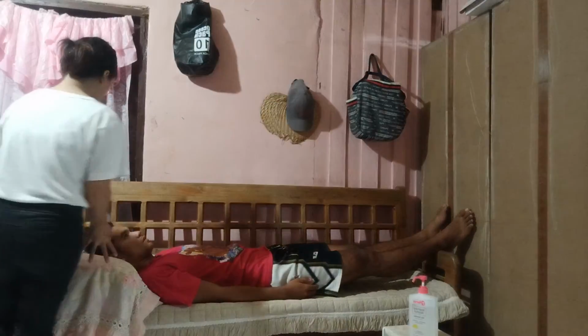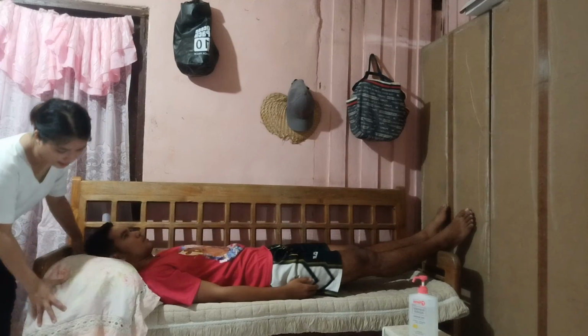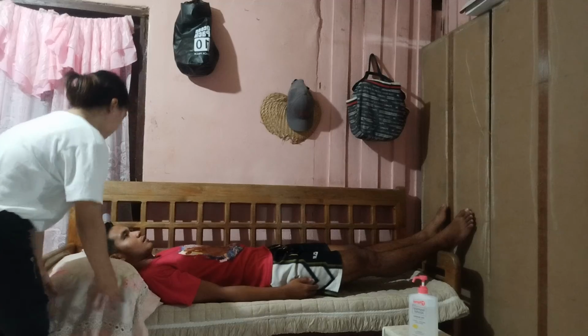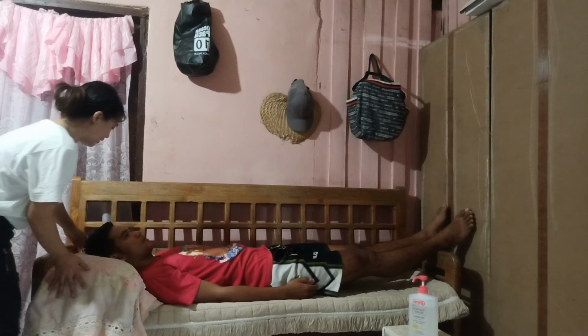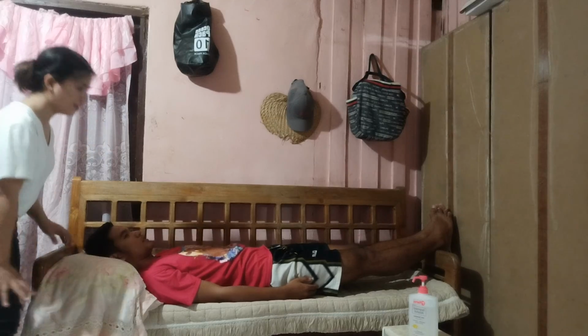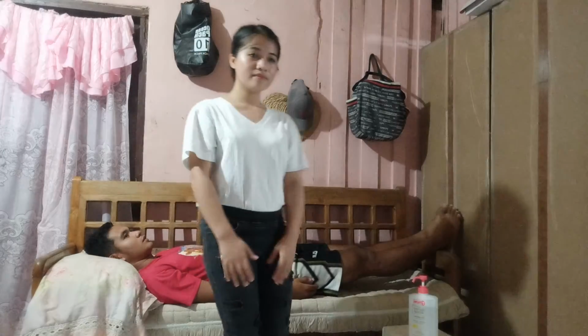The next step is to adjust the head of the bed to a flat position or as low as the client can tolerate. This is done to ensure that the patient's comfort is being prioritized. So let's flatten the head portion of the bed. Okay na niya position, sir. Okay ka nga ka-flat. Okay, sir. Okay, thank you, sir. Now let's proceed to the next procedure.